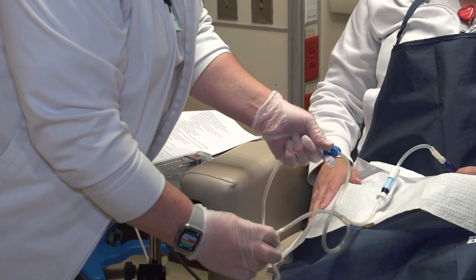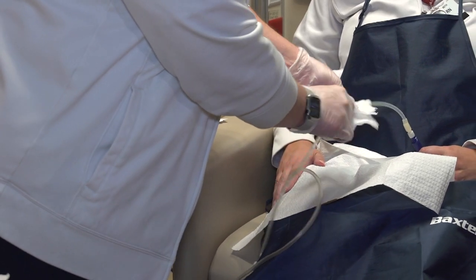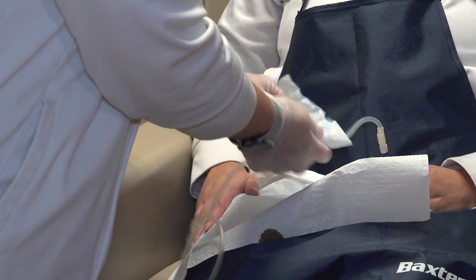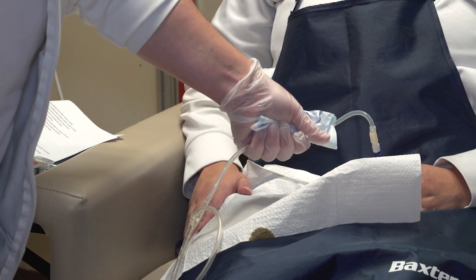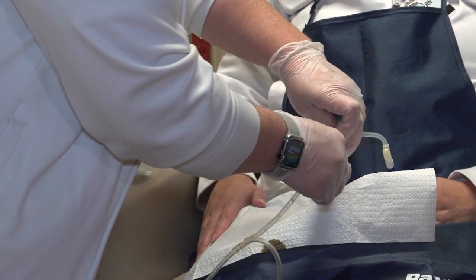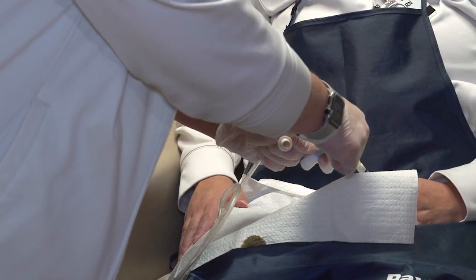This line has a clamp on the drain line, the patient line. So you will, again, scrub for 1 minute. Soak for 1 minute. And remove your bag and apply your mini cap to the transfer set.